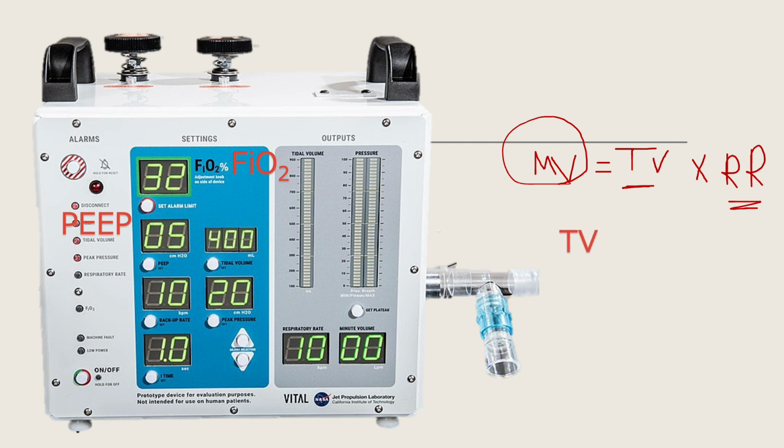And so if you want to simulate the real ventilation in a normal person, you would do that on the ventilator using a tidal volume of around 400 ml. Or you can calculate it based on the patient's body weight. That's 6 ml per kg of body weight. So let's say someone is like 50 kg, for example, then you would give them 300 ml.